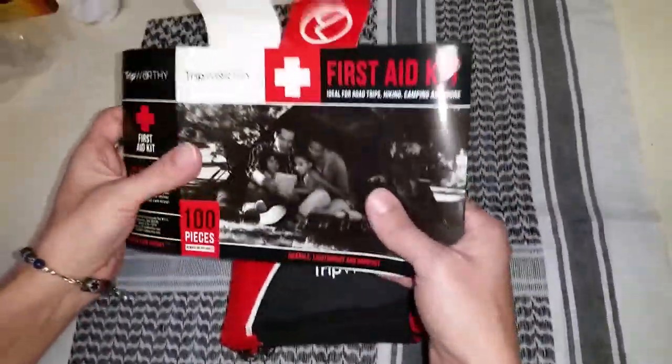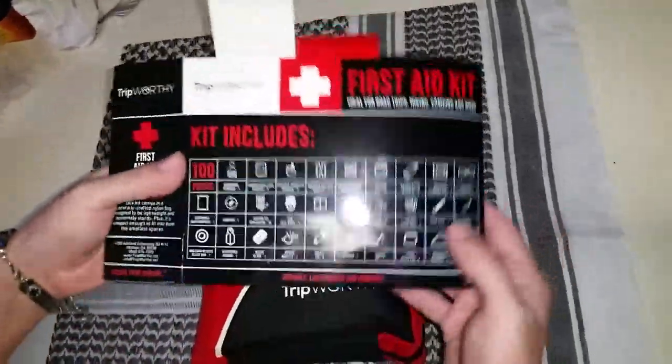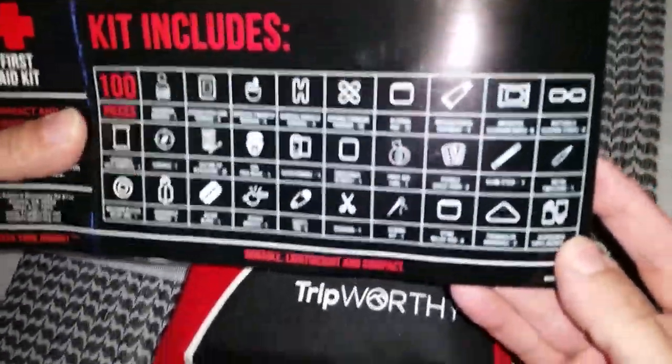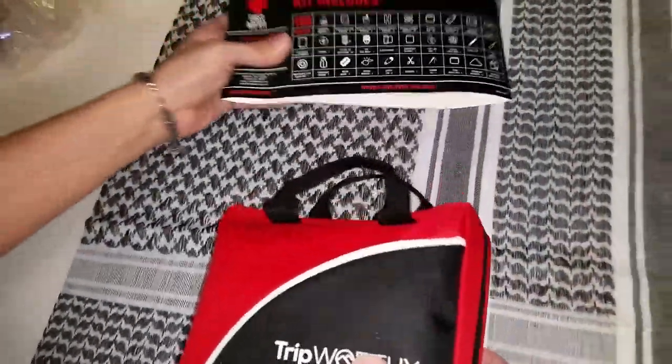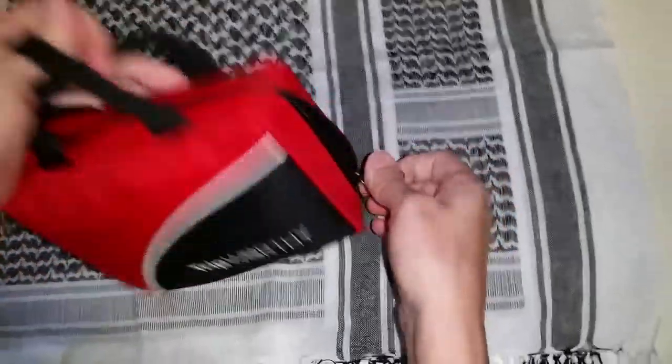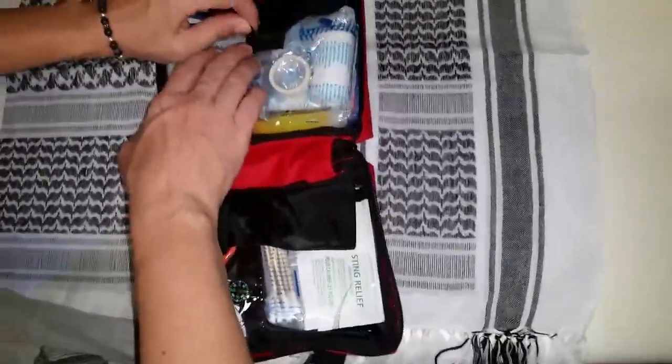It comes in this little sleeve upon arrival, and on the back it tells you what it has, so it breaks it down for you. Let's open it up and check it out. It does come with handles, and it's a good size if you want to stick it in your backpack.